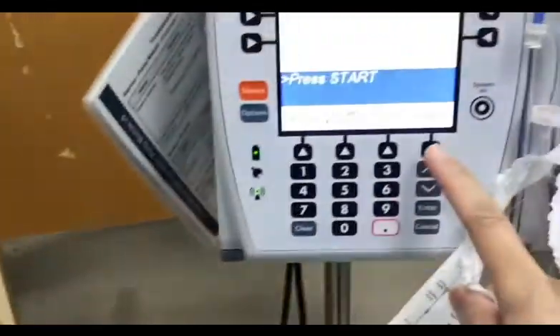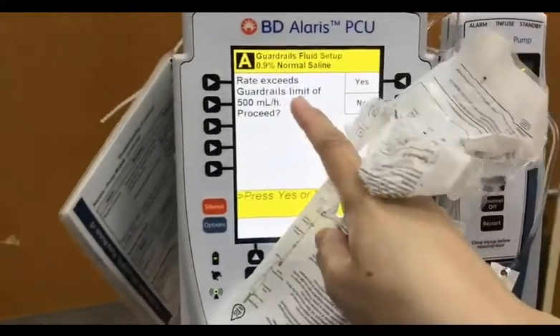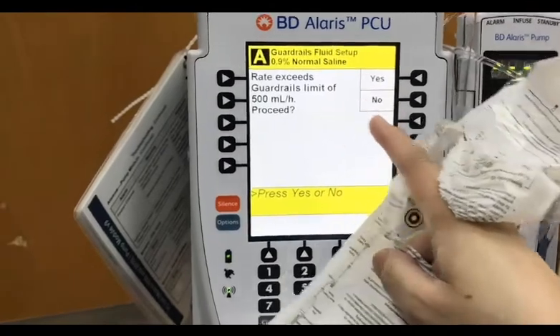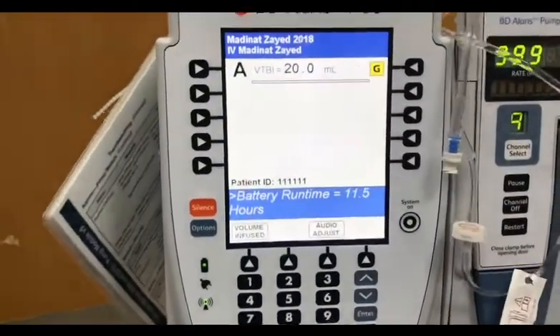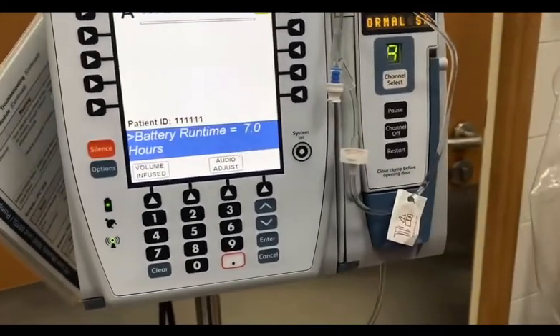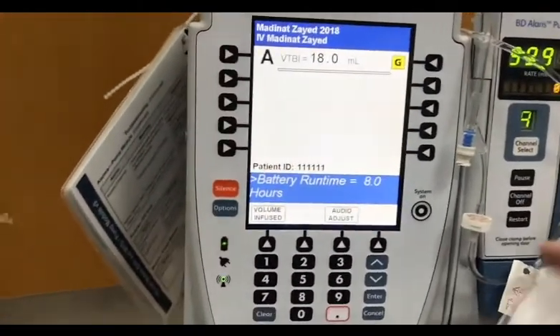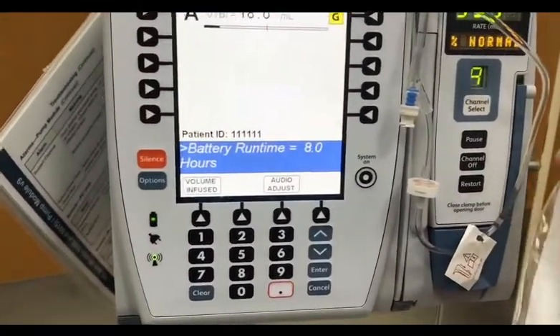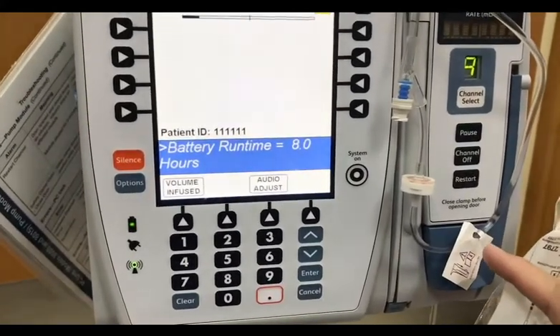After the setup, just press the start. And now, rate exceeds guardrails limit of 500 ml per hour. Are you sure? Yes. So now it is now infusing. So of course, I'm just infusing it here inside the plastic bag. So that's it. Wait until it finishes. It will just alarm once it completes the 20 ml.